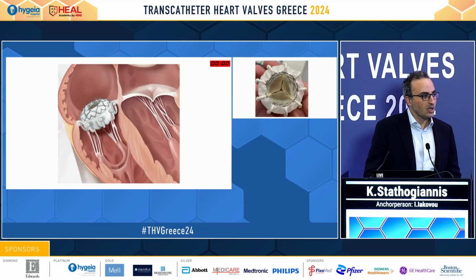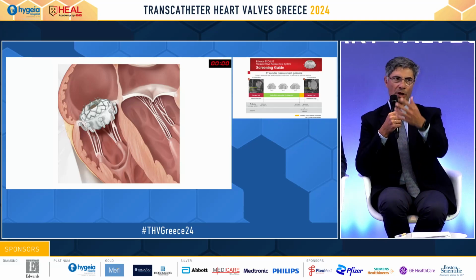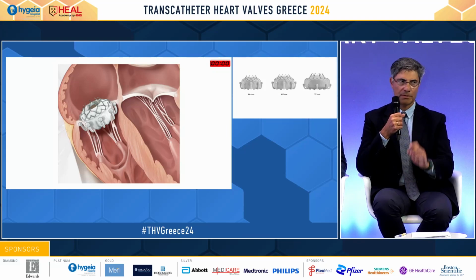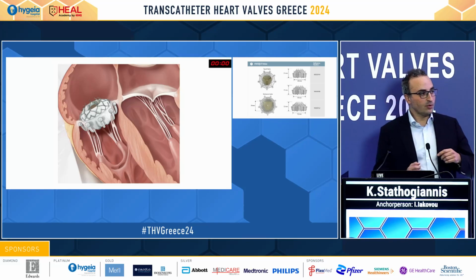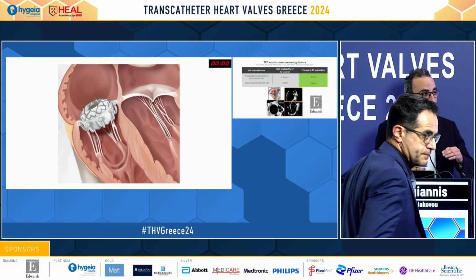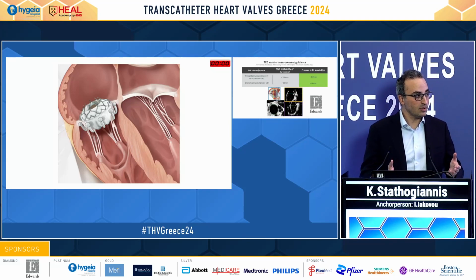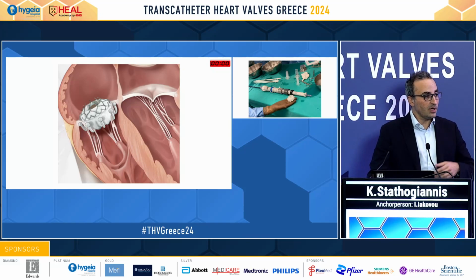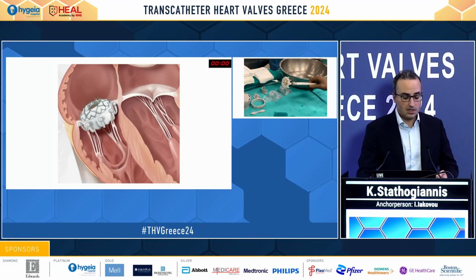Another question that I have: many of these patients have pacing wires. How do they fare when you place an Evoque? So the pacing wire, as we heard before, it's good that it has some slack, so you don't damage it. Of course, you need to have a backup plan in case everything goes wrong. We've done 3 cases with pacing wire. They had some slack, we didn't have any problem, and we need to work with the EP colleagues here as well.